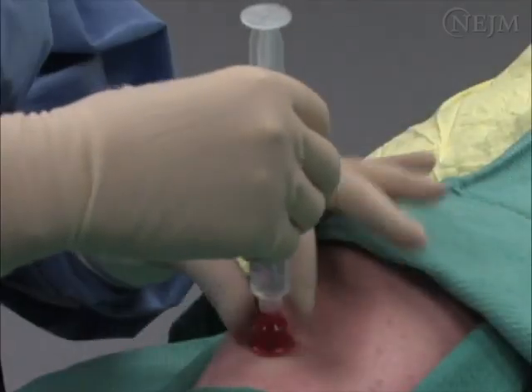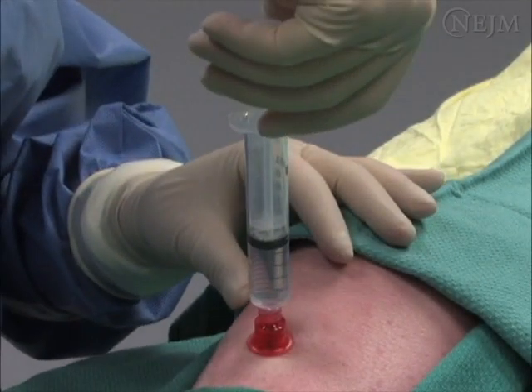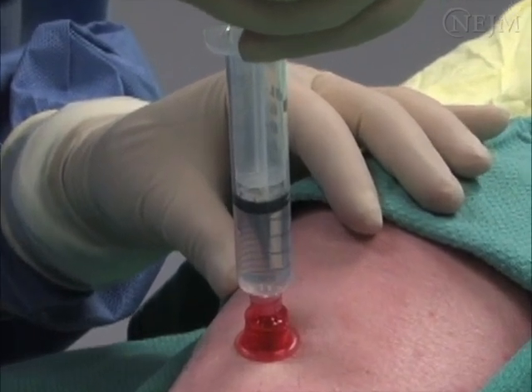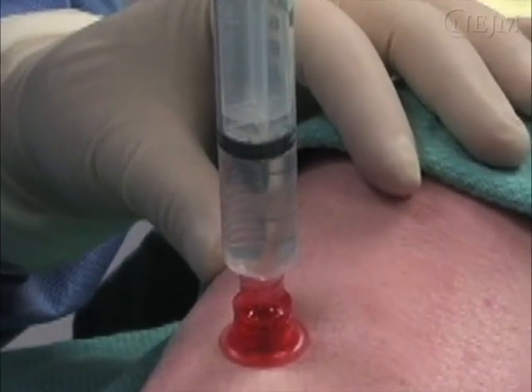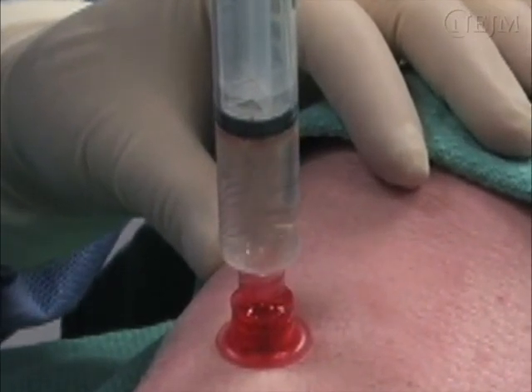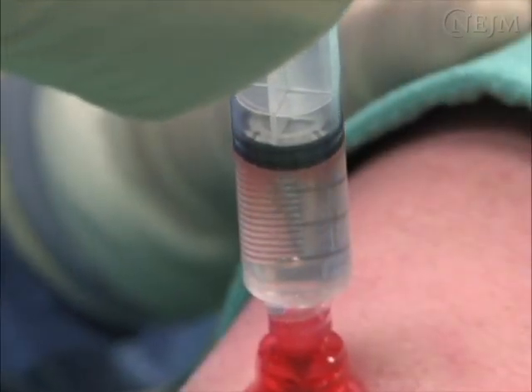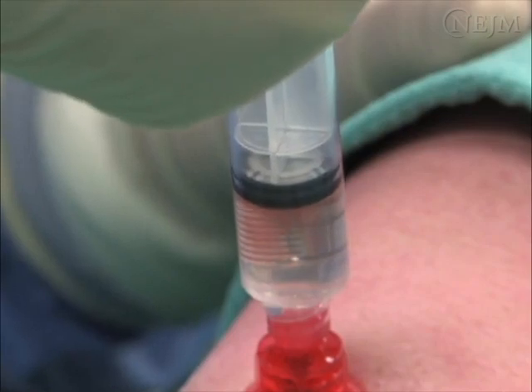Remove the stylet and connect the needle to a 10 cc syringe with a standard Luer lock connection. If the needle is correctly placed within the marrow cavity, the syringe should be able to stand upright without support. Aspiration of blood and marrow confirms adequate placement of the needle, but it is not always possible to aspirate marrow, even with adequate placement. Obtain confirmation of placement by infusing a 10 cc bolus of saline solution through the syringe.